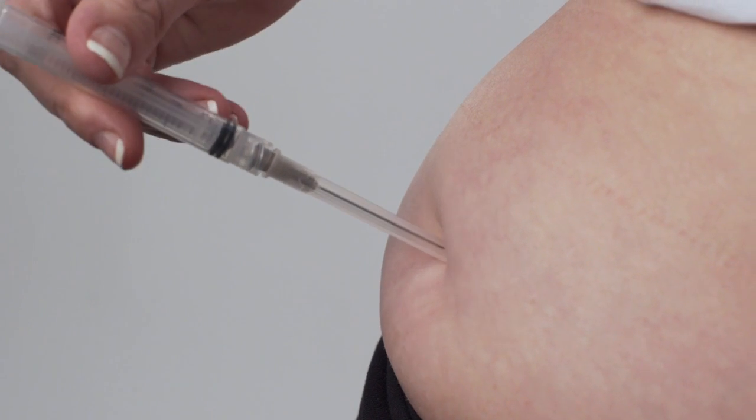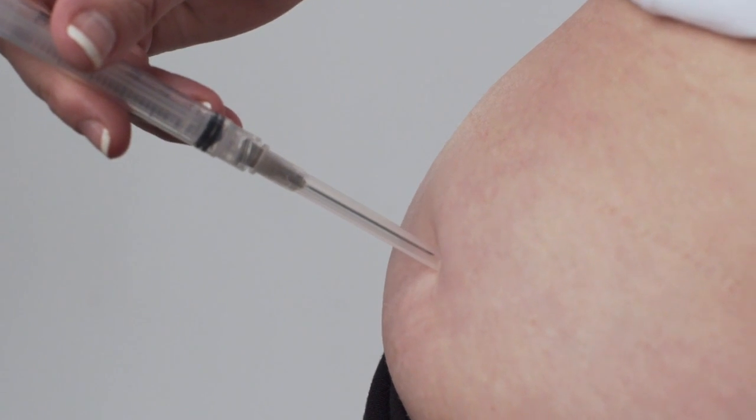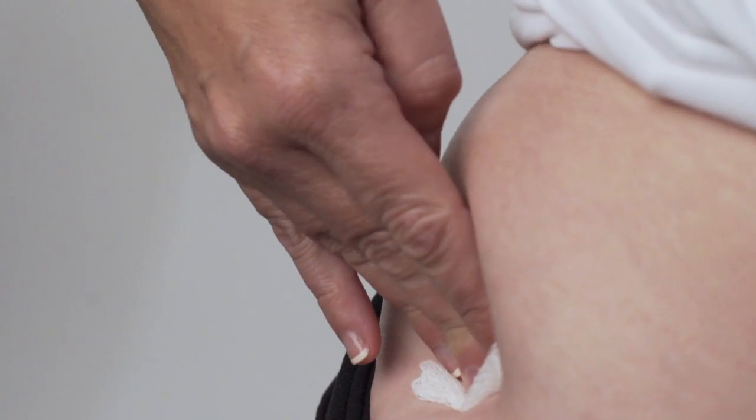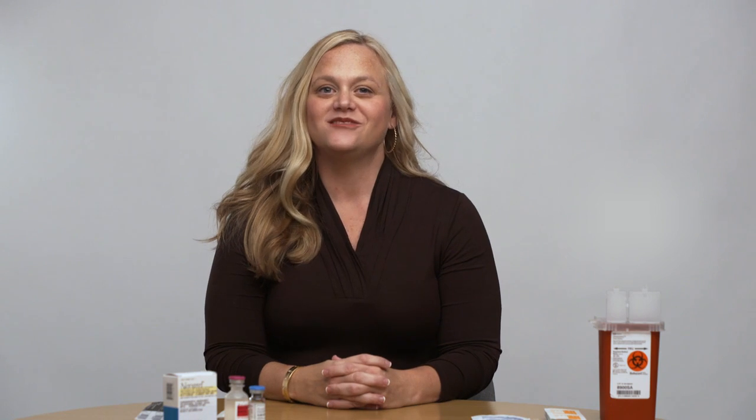Quickly insert the entire length of the needle at a 90 degree angle. Hold the syringe in your other hand and very gently pull back on the plunger just a bit to check for blood. Do not pull forcefully back on the plunger. If there is blood, you will need to change the needle and start the injection again at a different injection site — this does not happen very often and does not indicate a problem. If there is no blood, push the plunger in a slow steady motion until all of the medication is injected. Gently withdraw the needle and apply pressure to the injection site with a sterile gauze pad. If needed, apply a band-aid. Once your injection is complete, dispose of the used needle and syringe in your safety container.